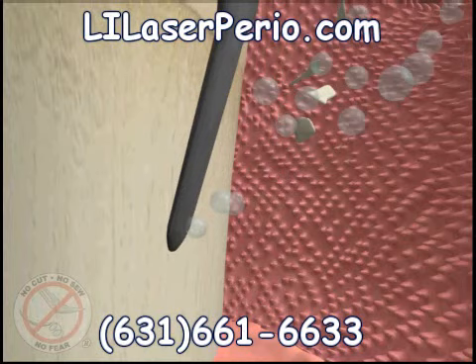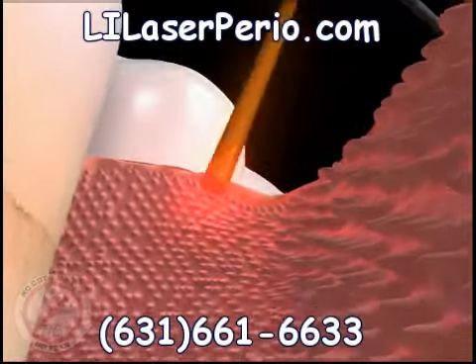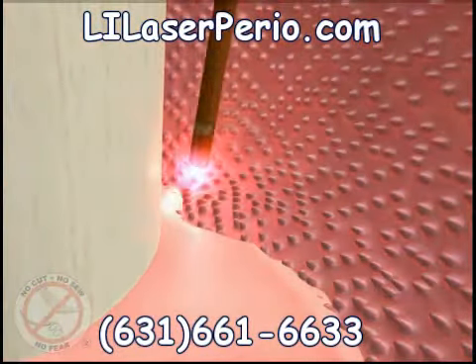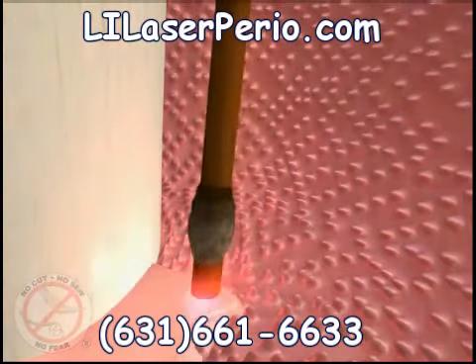Some hand cleaning instruments may be used at this time to remove any remaining hard calcium deposits. Then the laser is used again at the bottom of the pocket to remove any remaining diseased tissue. This pass of the laser also sterilizes the tissue and bone and completely eliminates the bad bacteria, germs, and toxins.